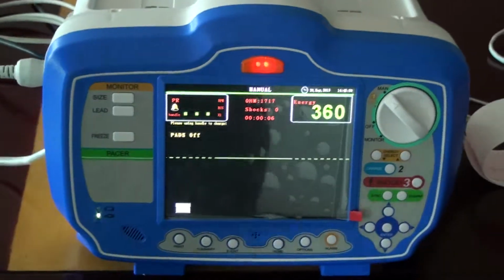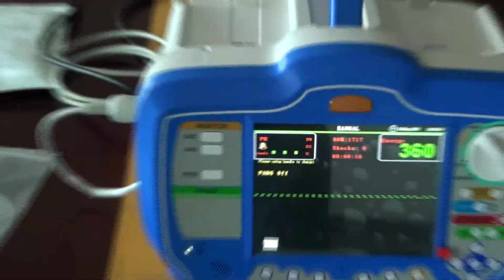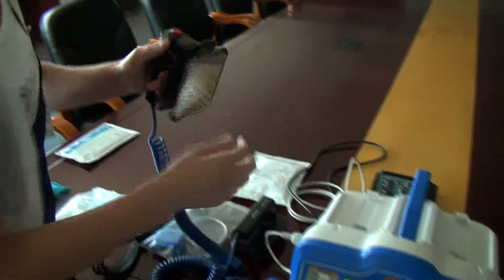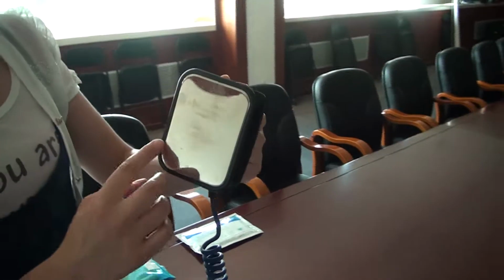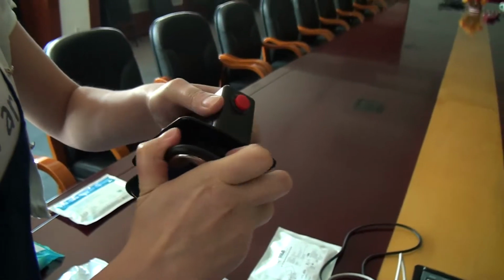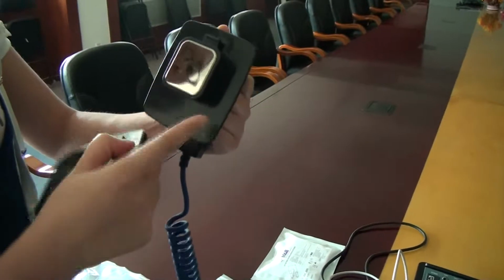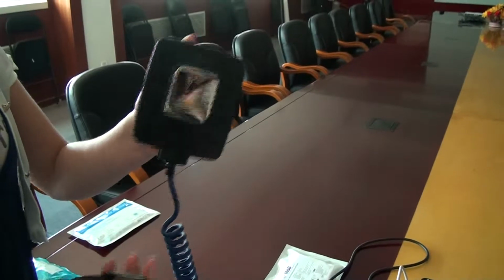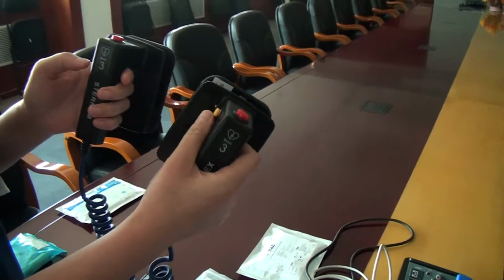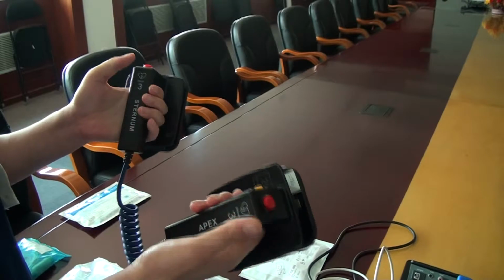Check the electrode. It will show the handles. Then we need to use our handles. Now we make an introduction for our handles. This one is used for the adult, and press this button to pull up. The small one is used for children. And they have 3 buttons. The yellow button is for charge, and the 2 red buttons are used for shock.